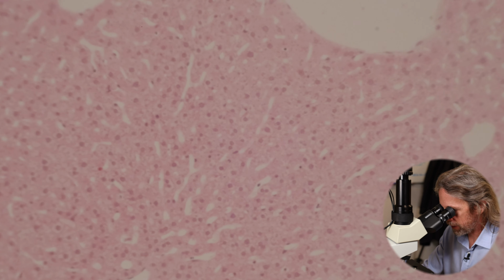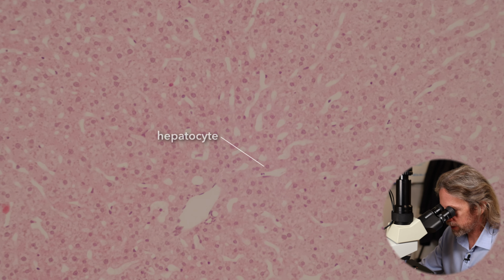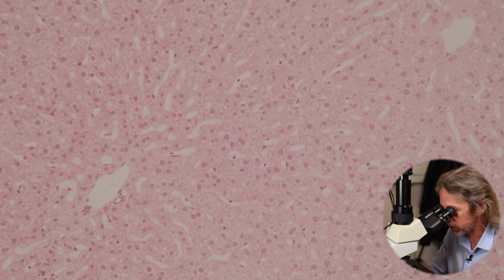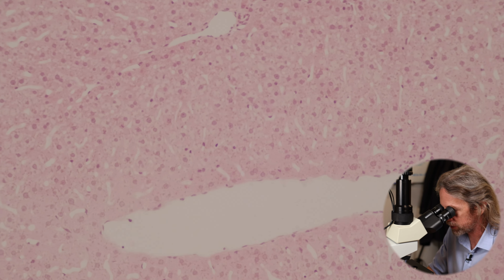So pretty much everything we're looking at here, these are all hepatocytes. So if I zoom in a bit, it's very palely stained, this tissue, but oh look. So right, what we're looking at here is mostly hepatocytes. These are almost entirely hepatocytes, but you can see the hints of channels. You can see those conveyor belts running alongside those hepatocytes, and we can see some bigger circles. So we're starting to see some of those inputs and outputs.